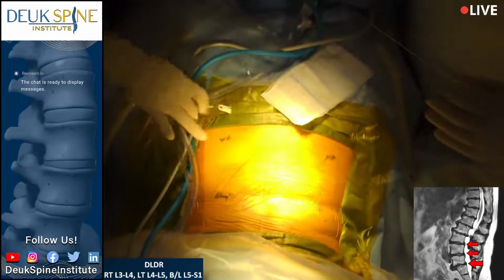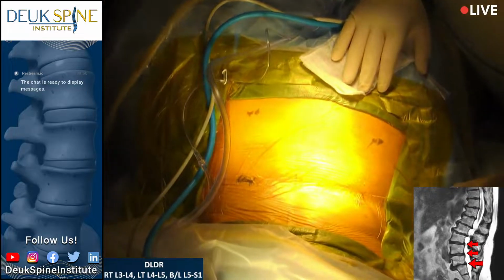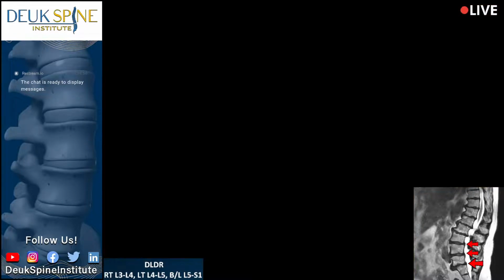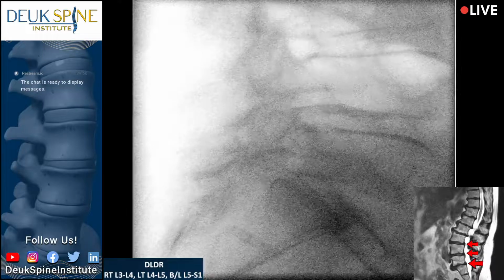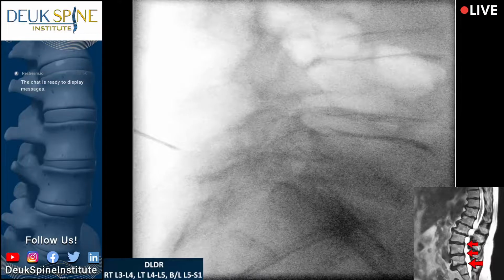All right, so that's local medicine we're giving her to numb things up and make it a little more comfortable. Shot. Yeah, you're too far north. Not sure why you guys went north. Don't go north. Clean up 5-1. That's where we're going to start. Shot.